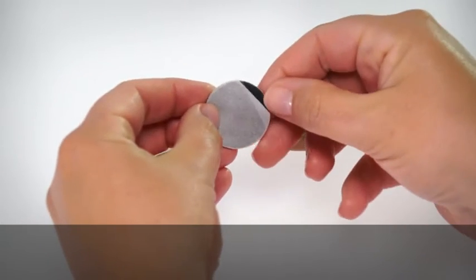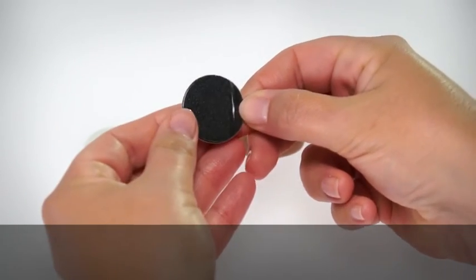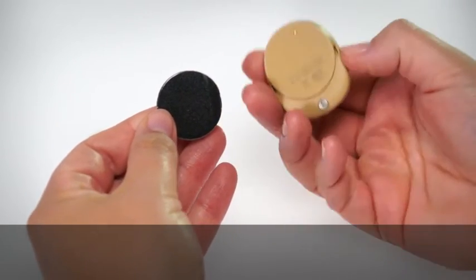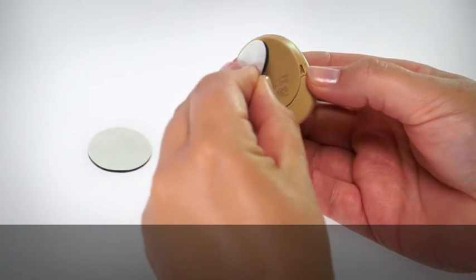Peel off the single backing strip on the adhesive side of the pad. Attach the pad to the back of the processor and press down firmly.